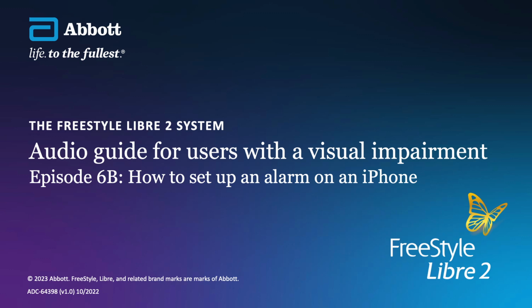High glucose alarm. Selecting the high glucose alarm option will take you to the high glucose alarm screen. At the top of this screen and to the right-hand side is a switch button, off. Selecting this will turn the high glucose alarm on. Note that turning on the high glucose alarm will automatically turn on the signal loss alarm, and a pop-up box will appear prompting you to OK this.